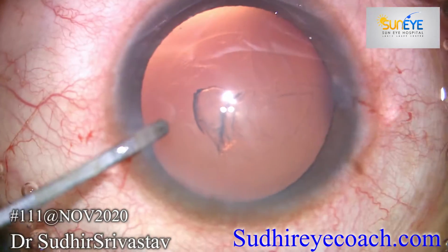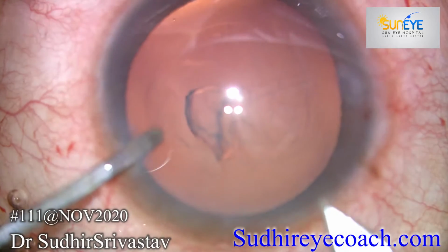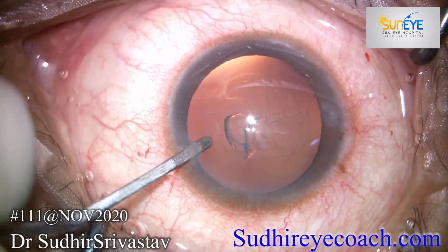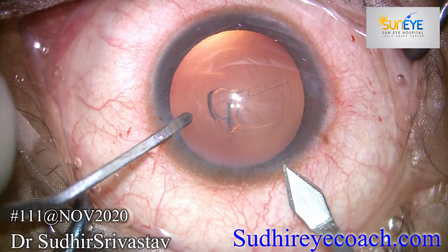Myopic eye behaves differently with pressure gradient change, and because of the shift of the iris and lens diaphragm, the patient sometimes feels a lot of pain. Irrigate the anterior chamber with intracameral anesthetic agent to reduce the discomfort.